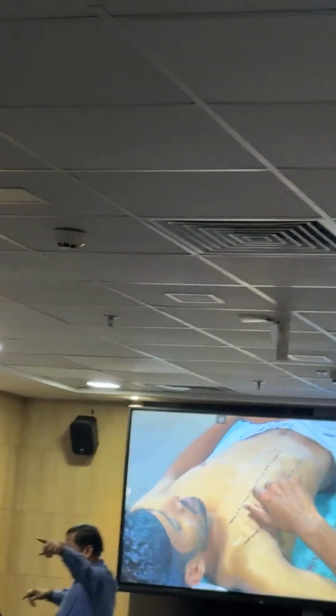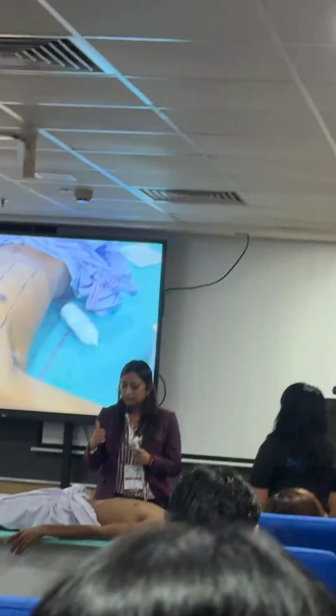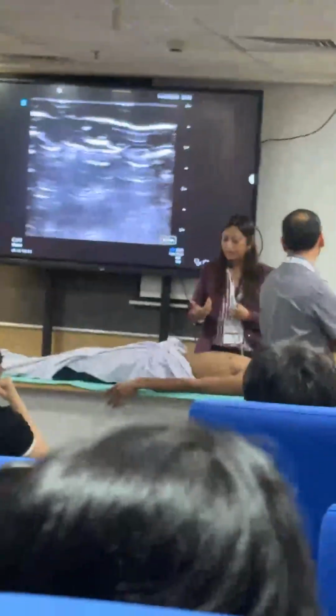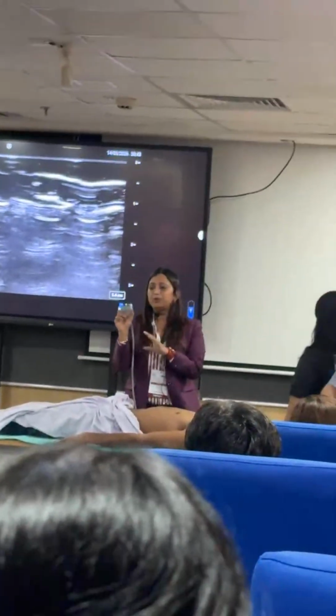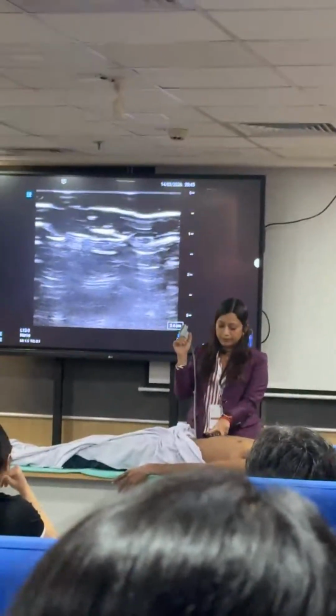So here you have to pick up for the anterior abdominal block. Now I am going to demonstrate the rectus sheath block, the mid-axillary block, and fascia transversalis block, the mid-ilioinguinal and iliohypogastric. For all these named blocks I will pick up the linear probe. Where to place your probe? Between the xiphisternum and the umbilicus you can put.